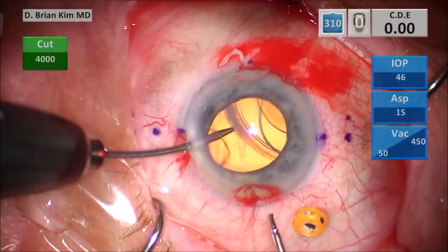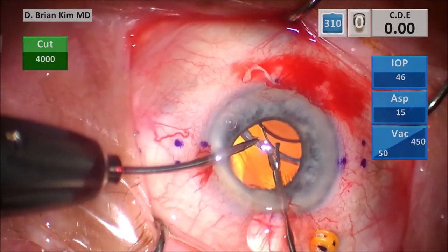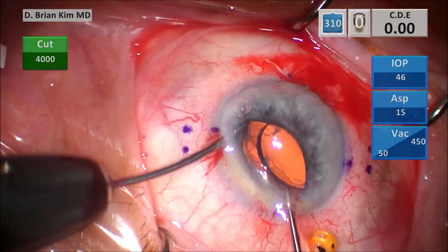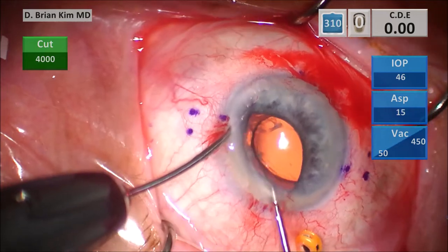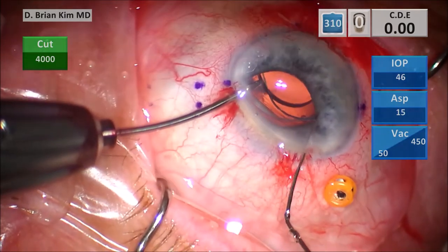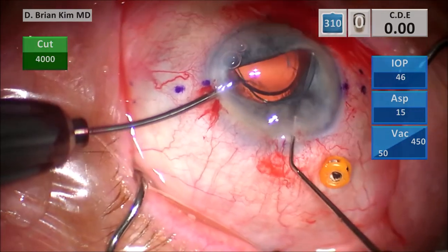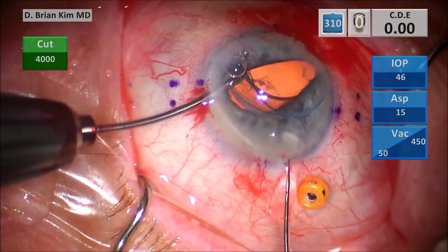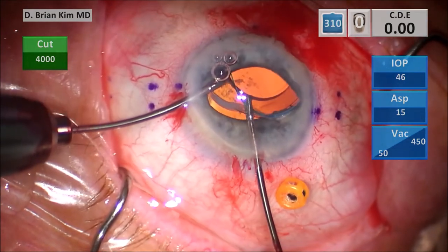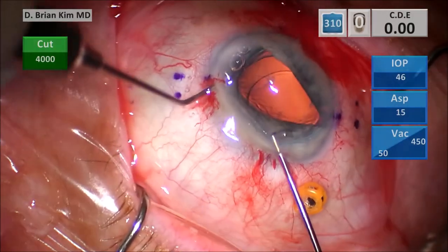I'm using two forceps here to grasp the CTR and the lens, and you can imagine it's a much bigger diameter than the pupil, so I'm going to have to use some maneuvers to get that complex up anteriorly. I switch hands — I have a Maltzman in my right hand and then I'm trying to retract the pupil and get the CTR and the haptic up anterior to the iris plane. Once I have that, I switch and grab with my right hand, with the Maltzman in my left hand, switching and trying to get that complex up.